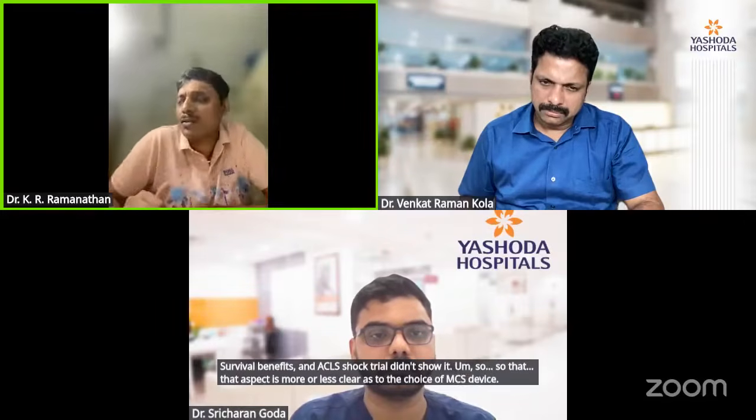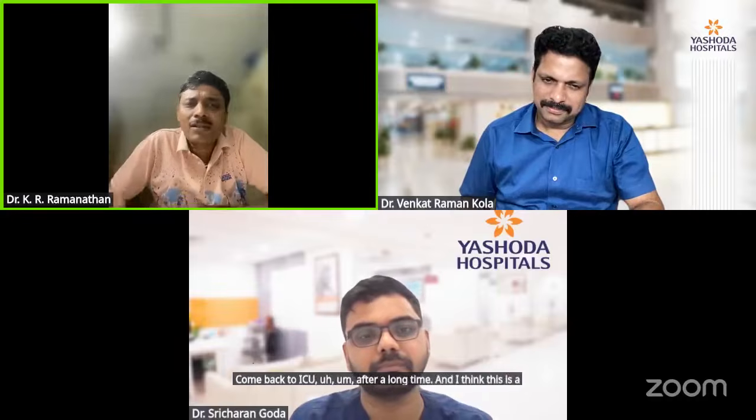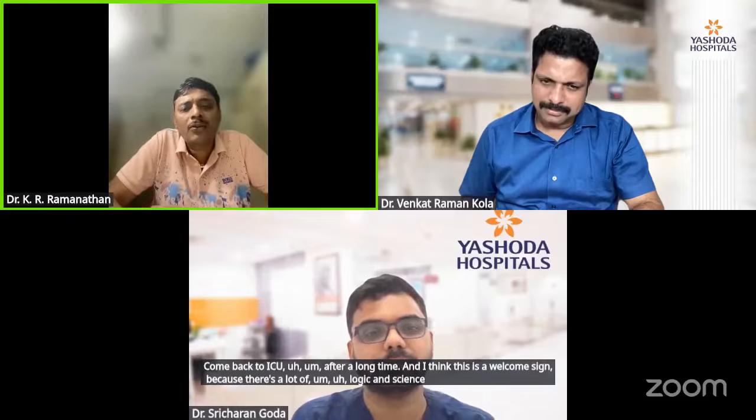Now, coming to the second question: should we be using PA catheters regularly? To me, PA catheters are making a comeback to the ICU after a long time, and I think this is a welcome sign because there's a lot of logic and science applied to the use of the PA catheter now, especially with advanced cardiogenic shock.